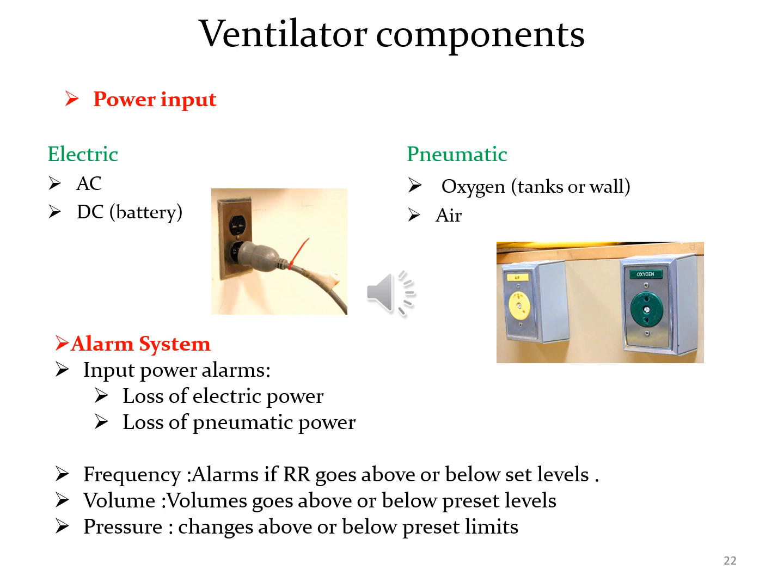The ventilator components. Alarm system. Ventilator alarms must never be ignored or disarmed. The alarm system ensures that the ventilation parameters set in the operating and display unit are actually applied. It also issues audible and visual alarms to alert staff to critical changes in the patient's condition or technical malfunctions.